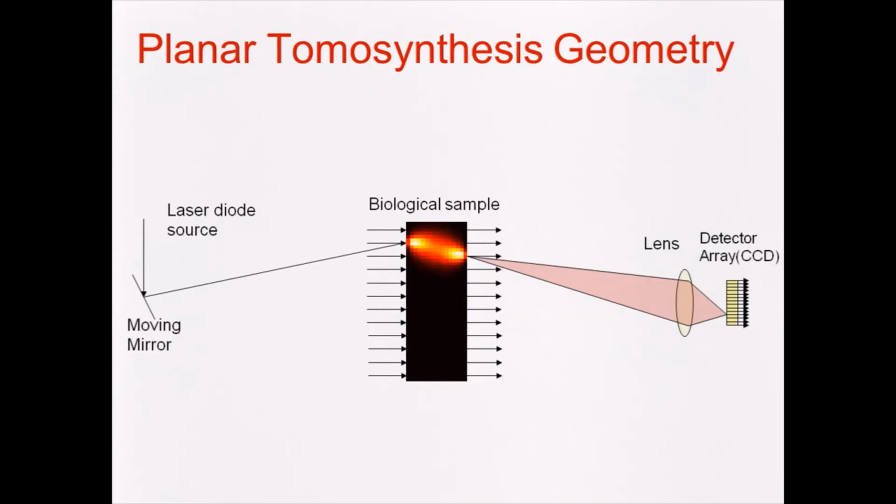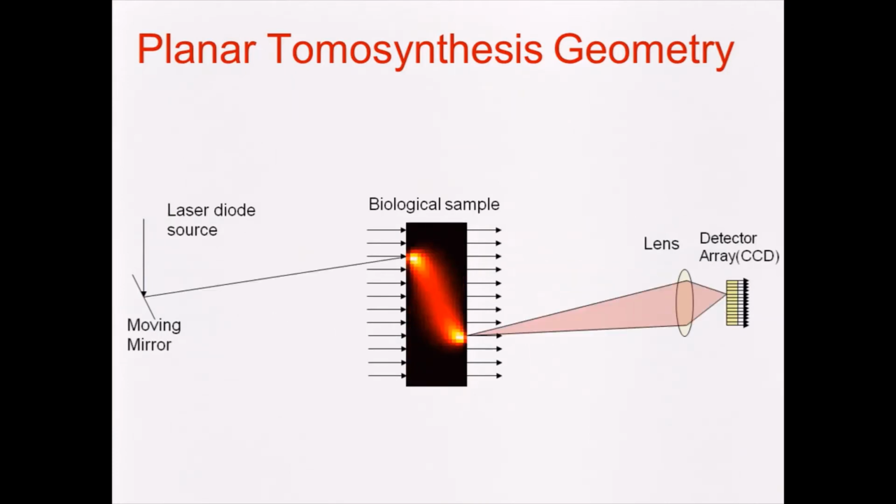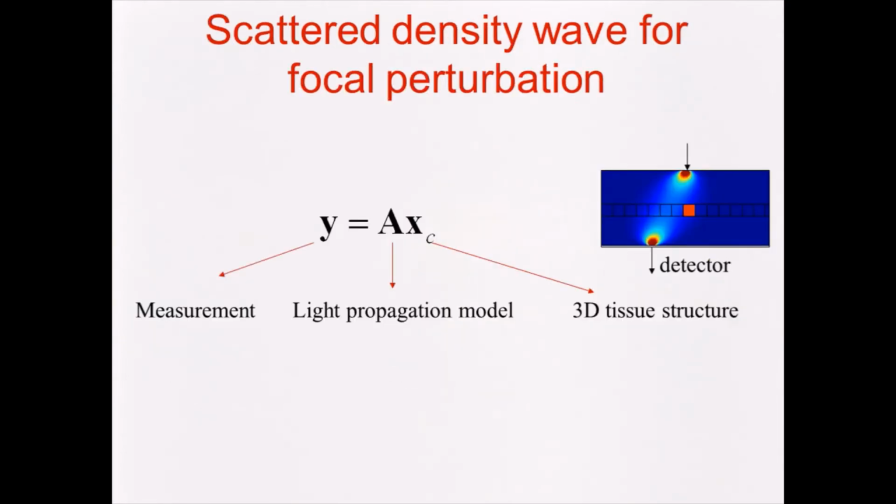Or you can look at a fixed detector and all the different sources, and it samples like that. And so if you consider this source detector pair and that source detector pair, you can see how they would triangulate out a deep signal from the tissue. So all of these measurements are then put into reconstruction algorithms to assemble them as you might assemble a CT image.